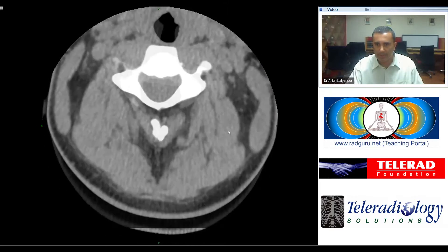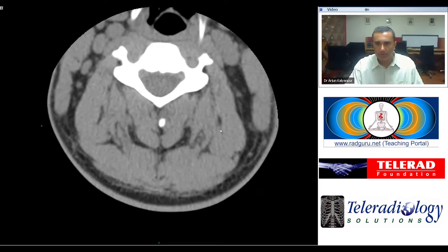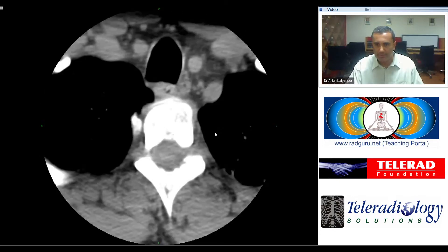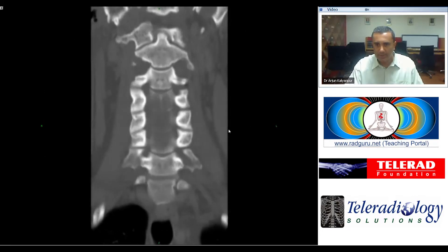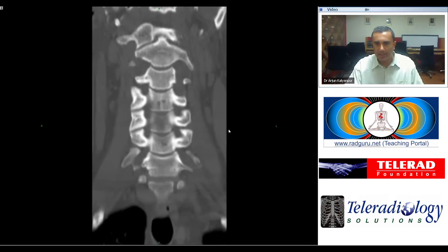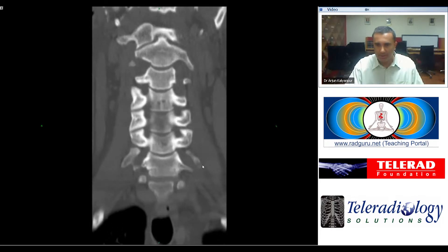But when we scroll through the reformats, on the coronal reformats you can see that it starts to look a little bit more real. There is a more obvious lucency in this left transverse process right here.